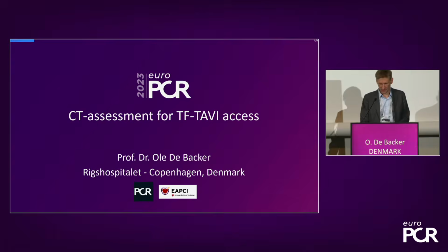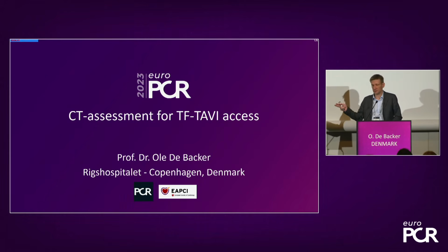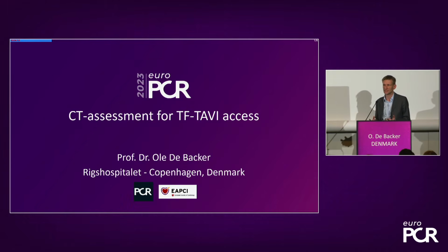Yeah, thank you. I'll keep it brief. But of course, if we do TAVI and we want a good access, as you heard, access and closure is really important. So of course, it's really key that we plan this pre-procedurally as well. I mean, it's not just going in the lab and doing your echo-guided puncture. That's one important point. But I think we have all this CT to look at the access and make decisions.